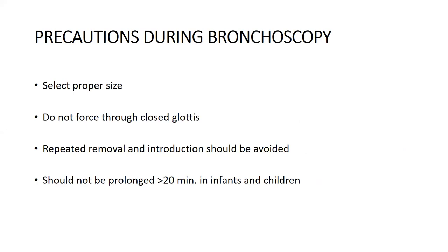So the precautions while performing rigid bronchoscopy are: select the appropriate size of the rigid bronchoscope and do not force it through the closed glottis, repeated removal and introduction should be avoided, and the procedure should not be prolonged more than 20 minutes in children and infants.